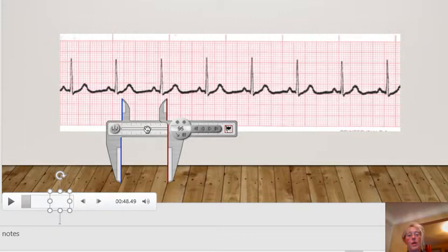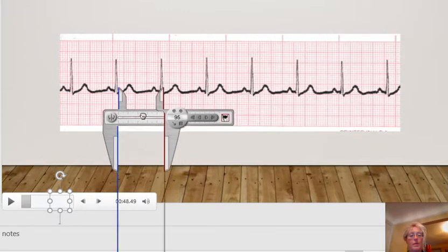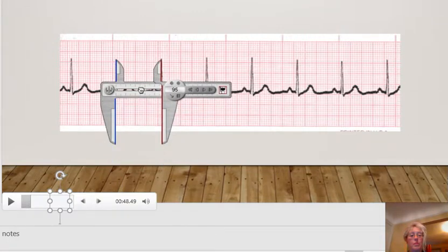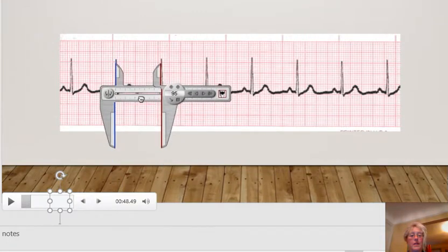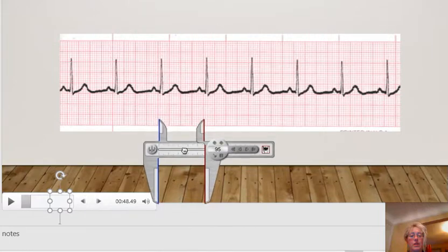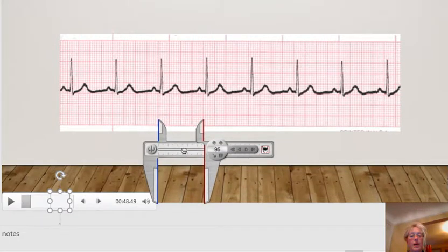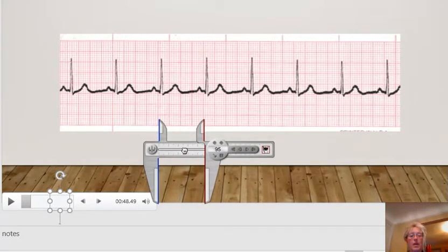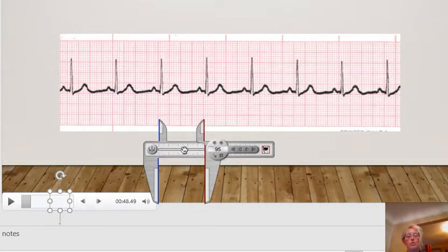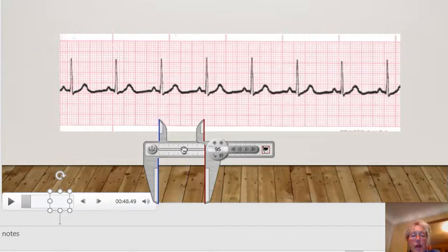So let's count the heart rate first. Let's line up our calipers between two of the R peaks like this. And let's bring them down to a nice vertical line. How many boxes do we have? Well, it looks to be about four boxes.